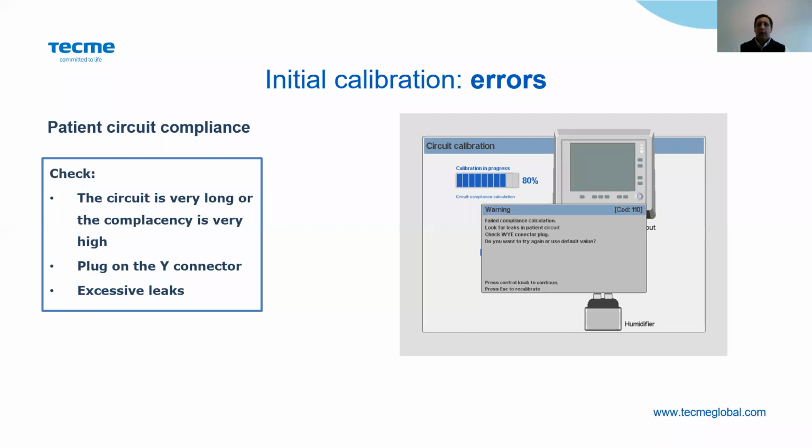Let me share another poll with you. What happens when the volume compensation is activated? Is the delivered tidal volume through the patient outlet lower, the same, or higher?